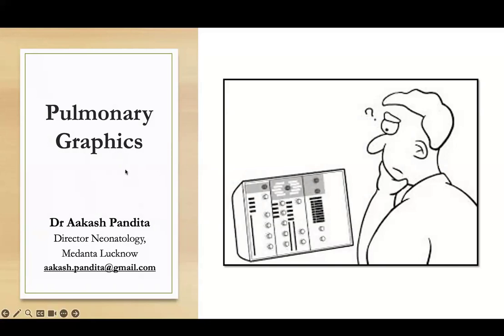And I think after that excellent lecture on modes of ventilation, my job is made a little easy. In the next 15-20 minutes, we'll be talking about pulmonary graphics. Basically, these days, our effort is more on being non-invasive, being a gentle neonatologist rather than a hardcore neonatologist who always has a tube and a laryngoscope in hand. We prefer not to use these tools unless and until we are forced to. So, day by day, we are trying to make ventilation as comfortable to the baby as possible.